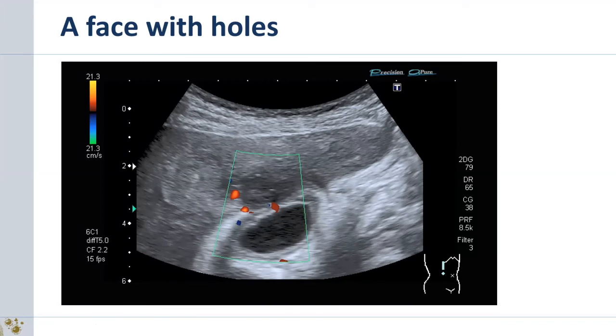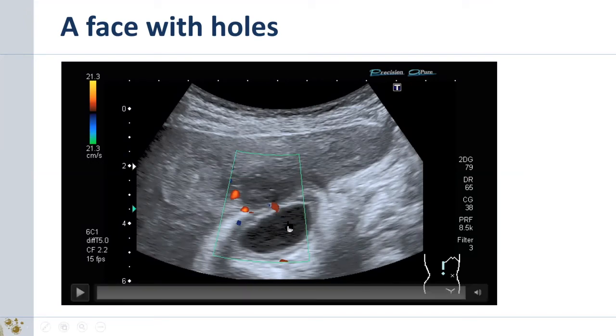Perforation. Yes, good idea. This is a perforation, and this is no blood flow. Any type of flow of fluids can be seen with color-coded duplex sonography. It depends on the flow velocity, and this is flow of pus between this abscess in the liver and the lumen of the gallbladder. And this indicated a puncture of this abscess and a drainage of the gallbladder.